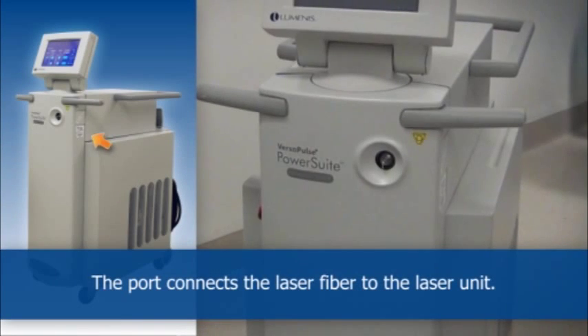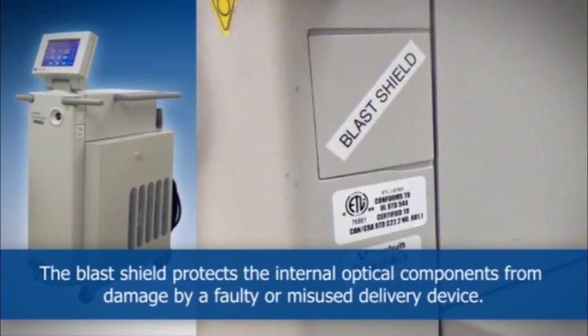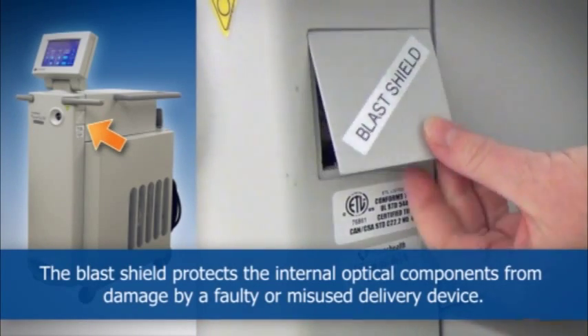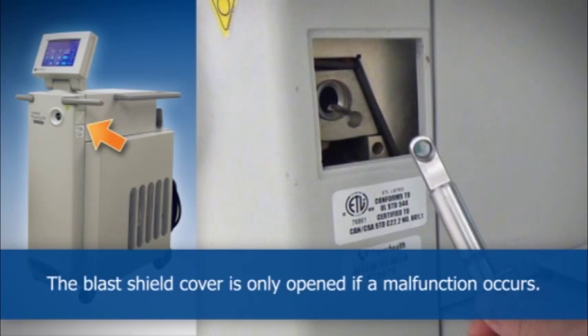The port connects the laser fiber to the laser unit. The blast shield protects the internal optical components from damage by a faulty or misused delivery device. The blast shield cover is only open if a malfunction occurs.